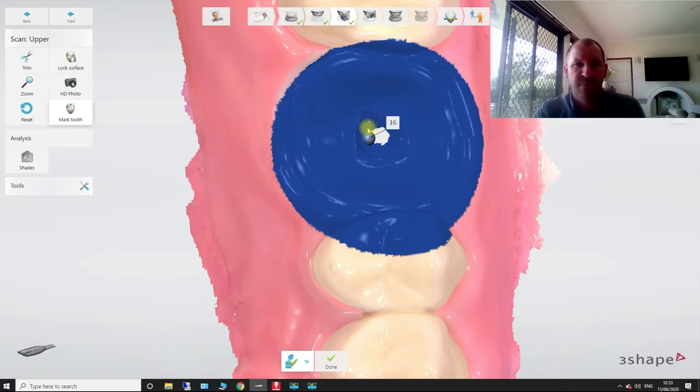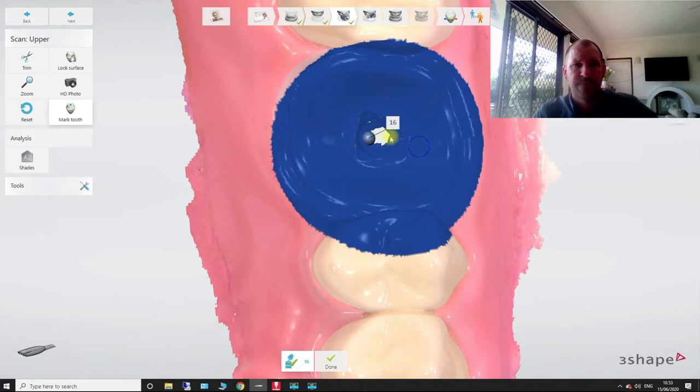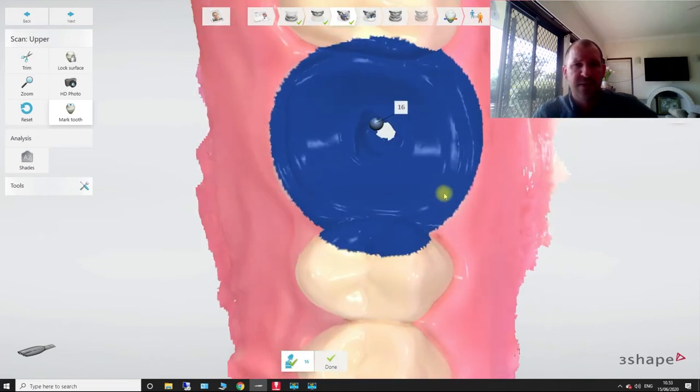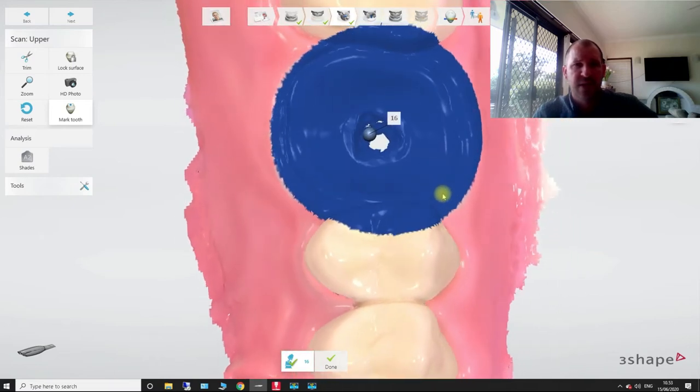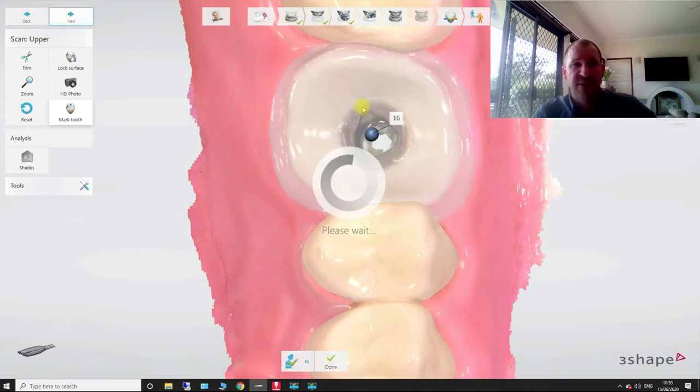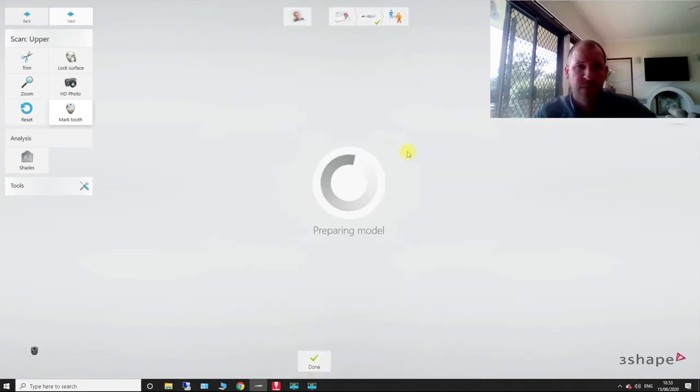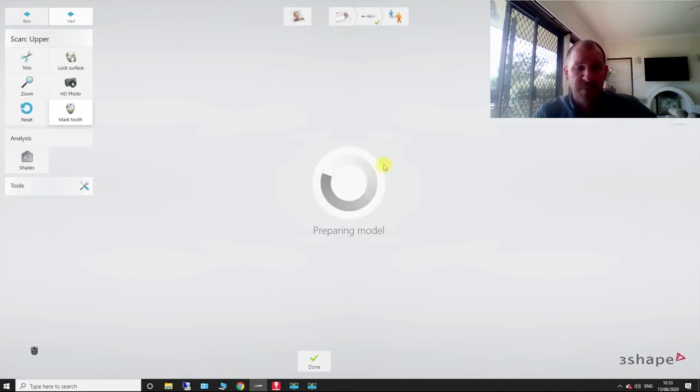So see how right now, basically, that 1.6, if I wanted to make that a smaller cutout area. So I'll show you if I go in next. So this is going to prepare the model.